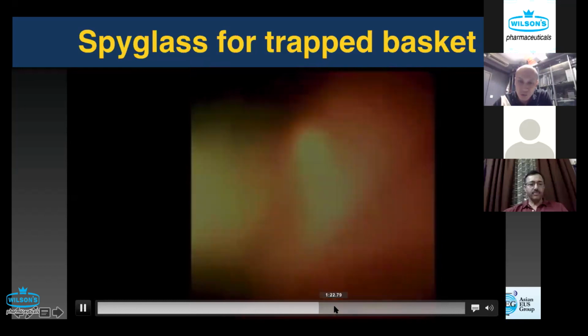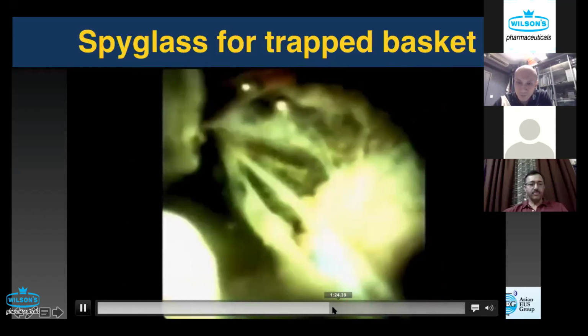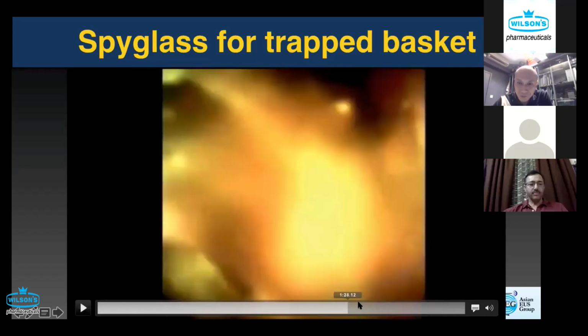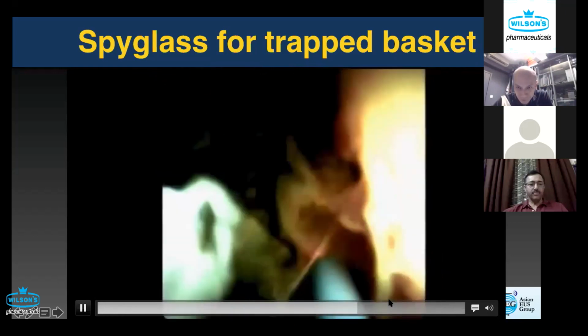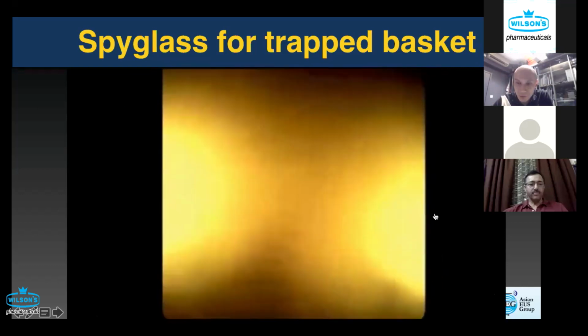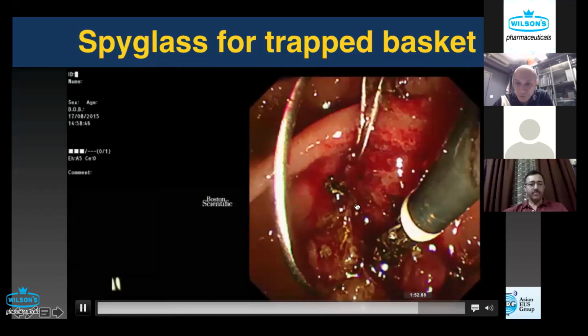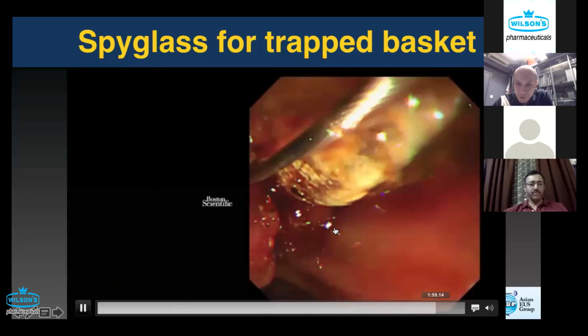we're able to do more and more fracturing right there. And then eventually we're able to take it out from the duct right there.